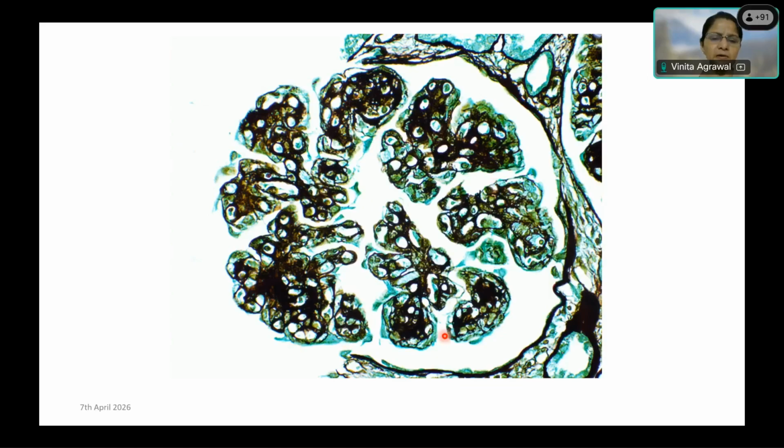See, for the last case I showed you, diffuse proliferative may show you some segmental double contours. But if you see global double contouring, then this is a case of, what is this pattern? Tram track is fine, but what will be the pattern when you talk of glomerular diseases?